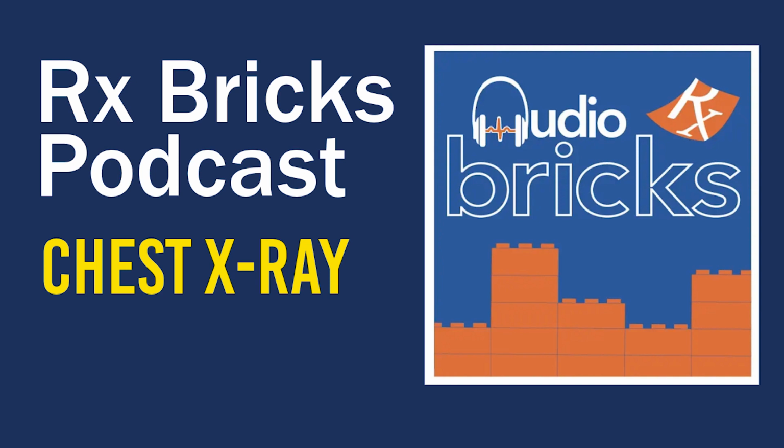Part 3. How do we ensure the quality of a chest X-ray? Before starting to make a diagnosis, you need to ensure the chest X-ray is of good quality. To do this, it is recommended to follow these steps. 1. Check patient identity. 2. Display X-rays correctly. 3. Correctly orient yourself left to right. And 4. Assess radiograph quality.